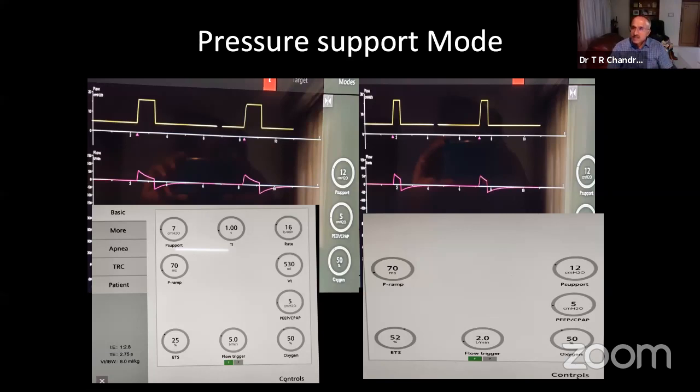I think we'll go with Saneesh. Sir, one more thing, can pneumothorax be identified by scalars? Any rise in peak pressures, because one lung is collapsed, all the air is going to the other lung, so peak pressures will shoot. So you know something is going wrong. Then if you look at the chest and auscultate, probably you will find out. If the right side of the chest is not moving, then you may get an X-ray, but it will definitely indicate with a rise in peak pressures.